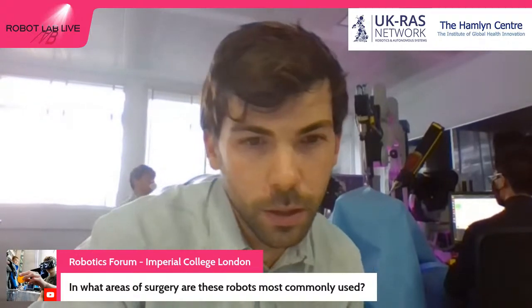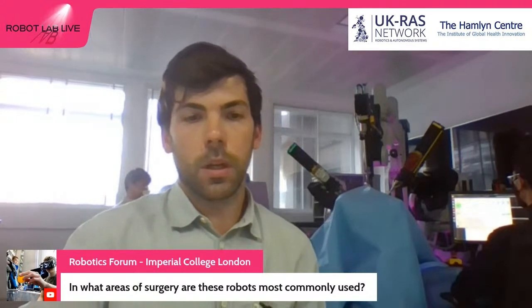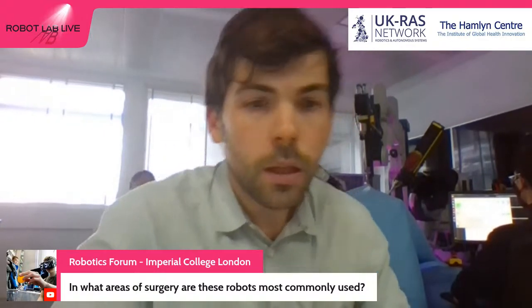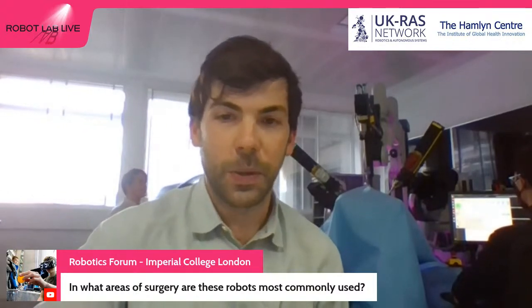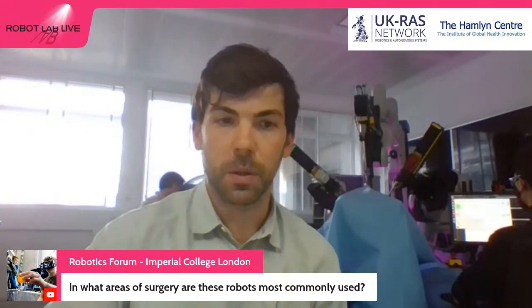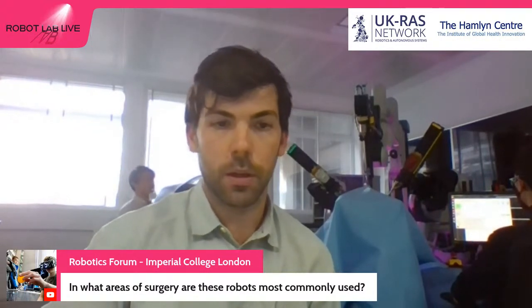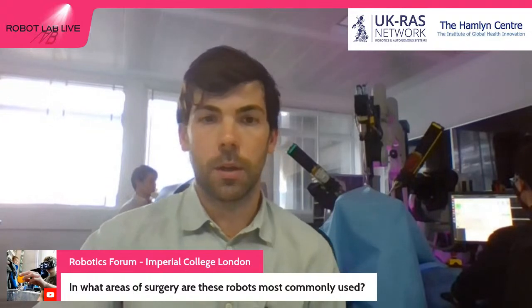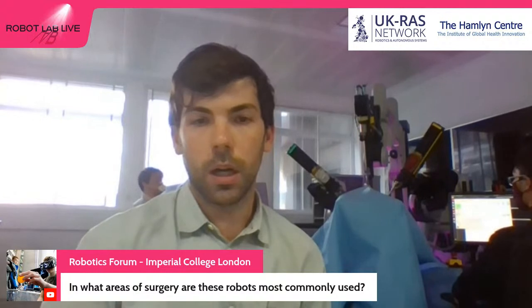Sorry. In what areas of surgery are these robots most commonly used? So these robots have been used in pretty much all surgical procedures, but they are most commonly used in laparoscopic surgery, as these tools are very similar to laparoscopic tools.